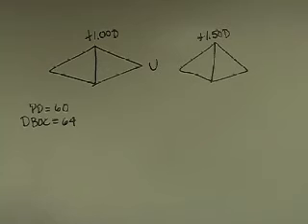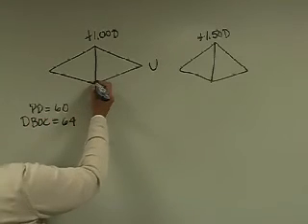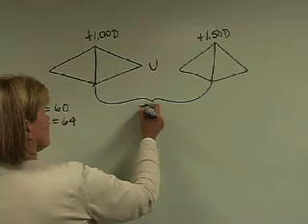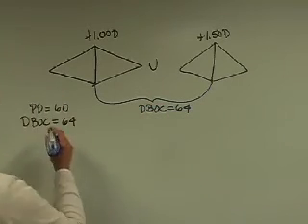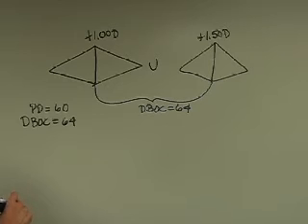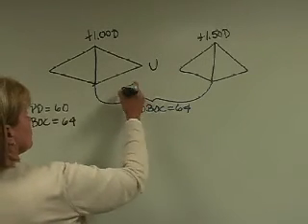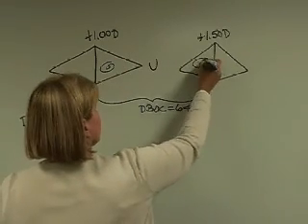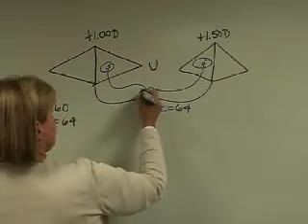The first thing to do would be to take my picture and label the parts that we know about. We know where the DBOC is. It's where the two bases meet in a plus lens. So let's identify. Now, in this case, the patient's PD is smaller than the DBOC, so the patient's going to be looking somewhere in between here to be the 60. So let's draw some eyes in. They'll be looking through this part of the lens when they're looking straight ahead.